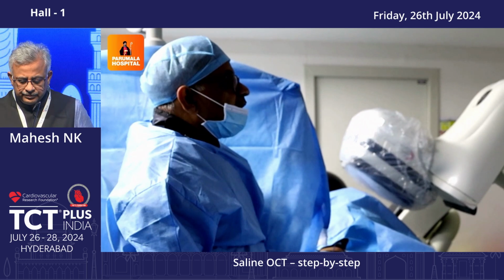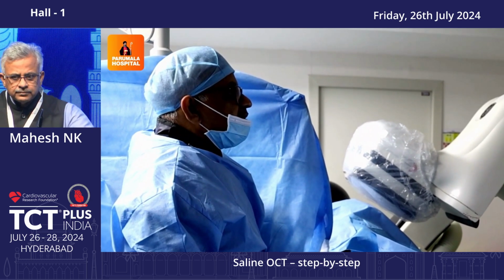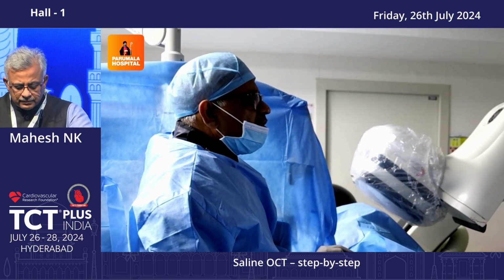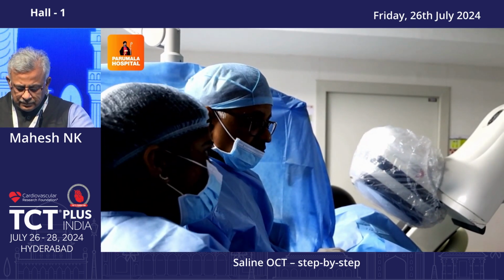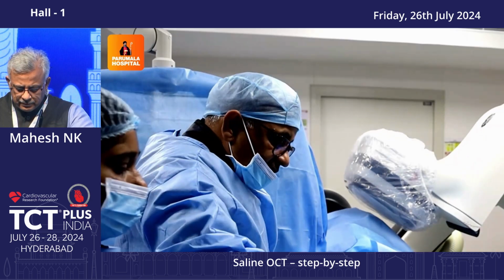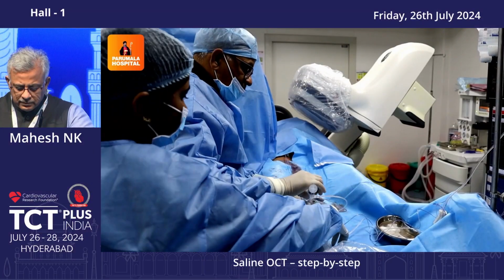We just introduce a catheter just beyond the area of interest. Just make sure that your catheter is coaxial. Confirm it by a small whiff of contrast. Small whiff of contrast, please. Okay, you're coaxial. That's good. So after that, you change from this to a 20 cc syringe. I use 20 cc for this.